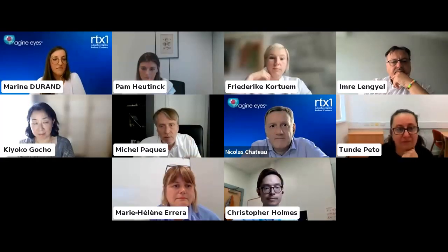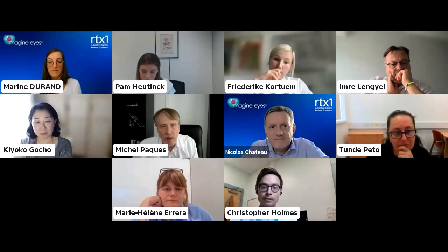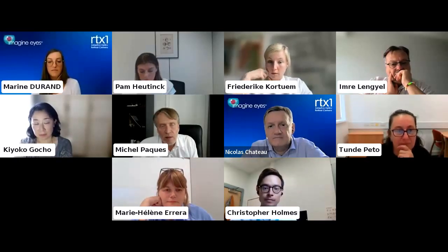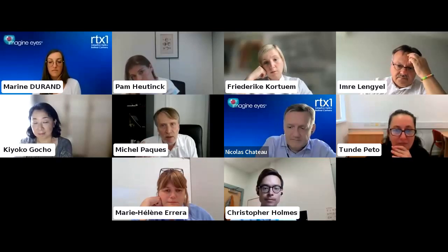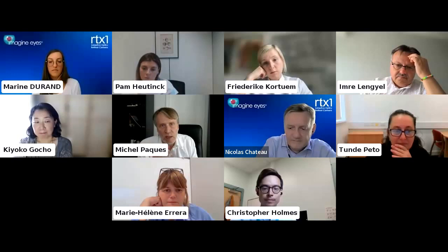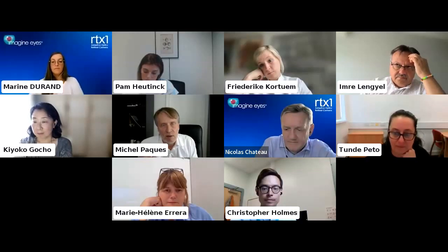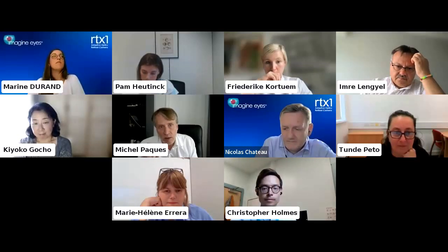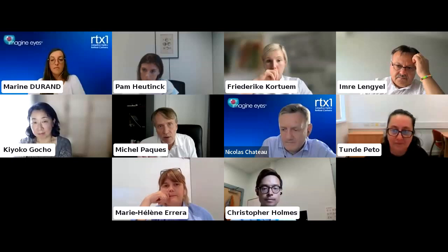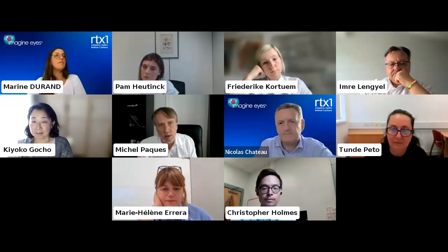May I ask a question? I was surprised myself with the case of AMD and using TFI. The most prominent thing I can observe is that it's a very powerful way of detecting pigment aggregates. It seems that the limit between RPE and atrophy is blurred, so you have a higher contrast of these pigmented cells all over the place. These pigment spots are usually easy to see over atrophic areas, but they're much more difficult to see over the persistent RPE. And TFI increases our capability of identifying additional pigmented cells over the persistent RPE, which improves our phenotypic capabilities in these patients.